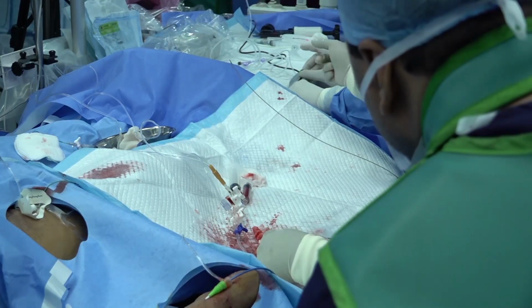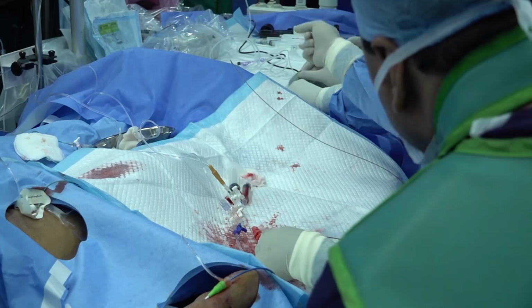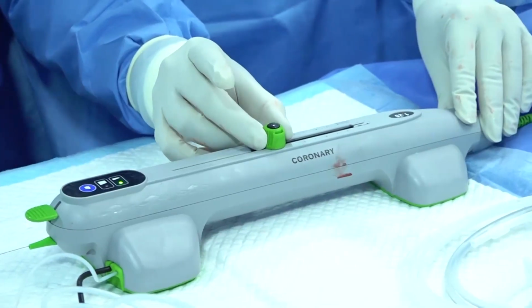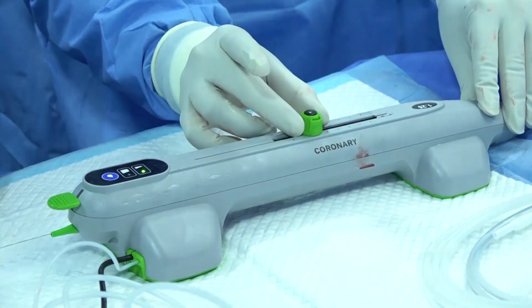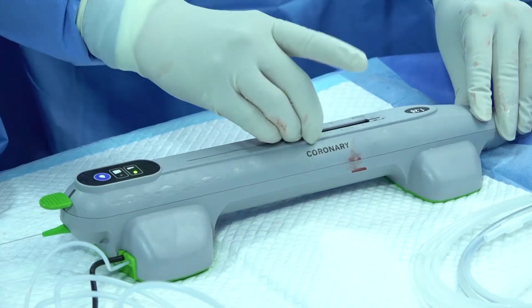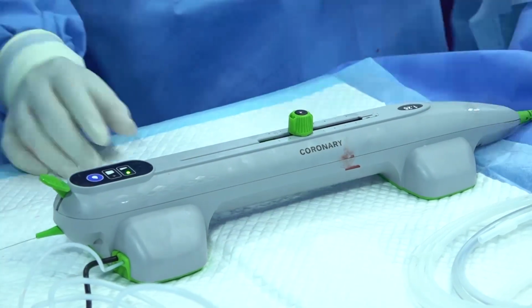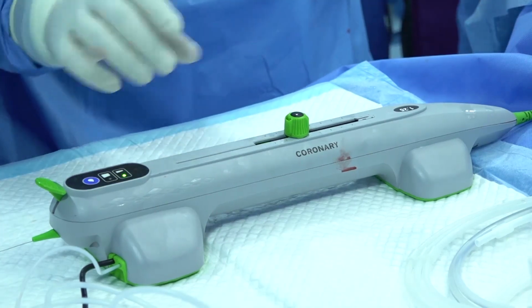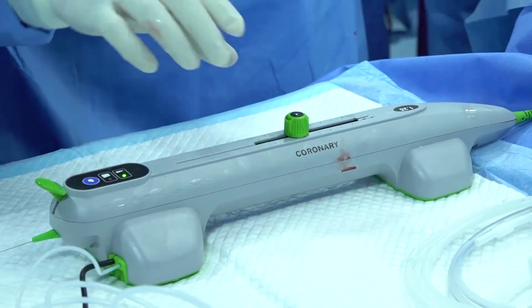Now the third thing is, look at the advancer knob. Show this particular area. Make sure that the knob is moving forward and backward smoothly. And then finally, regarding the brake, it has to be on when you check it, release, as well as when you are inside. Release. Now again the brake has been released. Yes, now we'll go in.